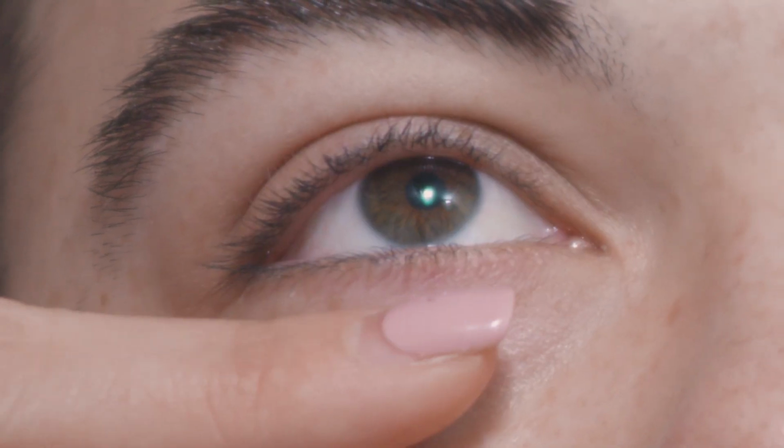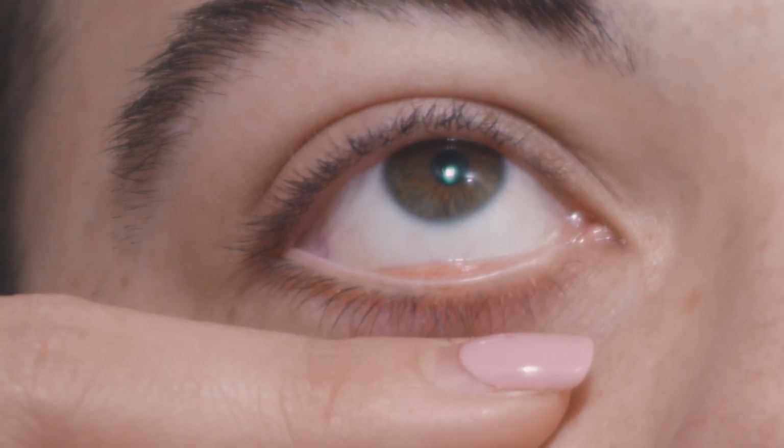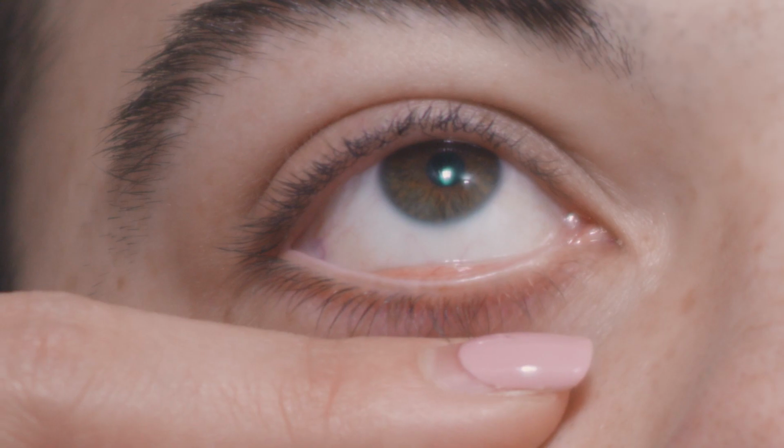So what I typically do to start is I will use a punctal dilator, which is kind of like a little probe that opens up the tear duct. The tear duct is actually right here. A little tiny hole in the corner, that is the puncta right there, and that's what we're gonna be putting the plug into. So here's what it looks like out. This end is the dilator, and then this end is where the plug is. This button is a little release button, so once I get it into the pore, I just hit the button and then it will let go.